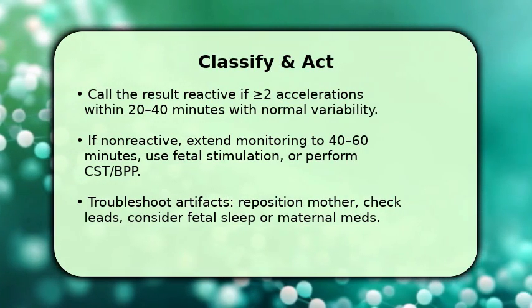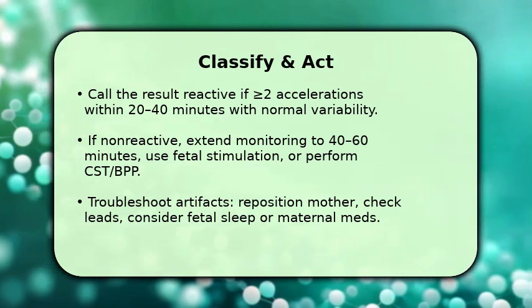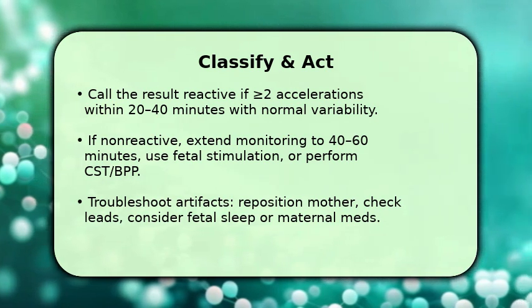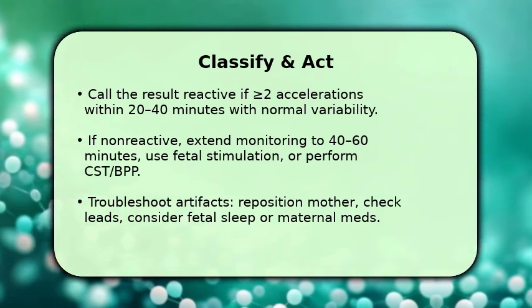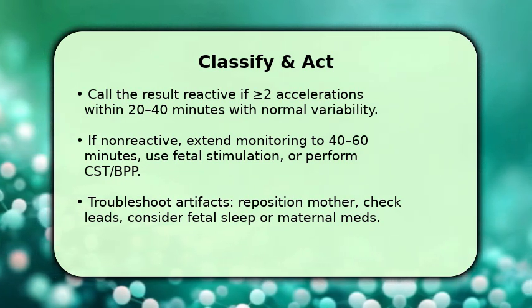A reactive tracing has at least 2 qualifying accelerations within the observation window and preserved variability, meaning reassuring fetal status. If non-reactive, extend monitoring to 40 to 60 minutes and try vibroacoustic stimulation. If still non-reactive, escalate with a contraction stress test or biophysical profile.